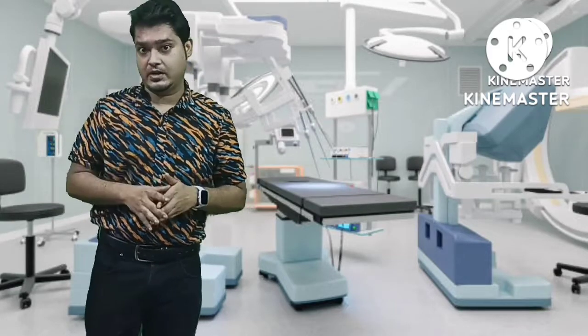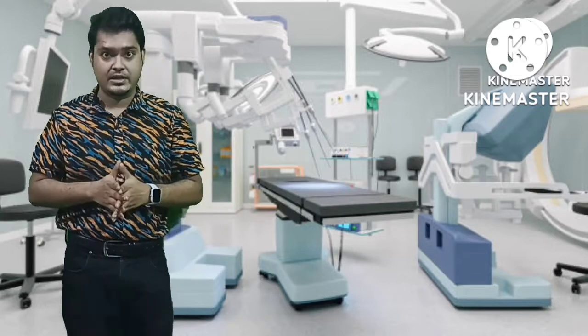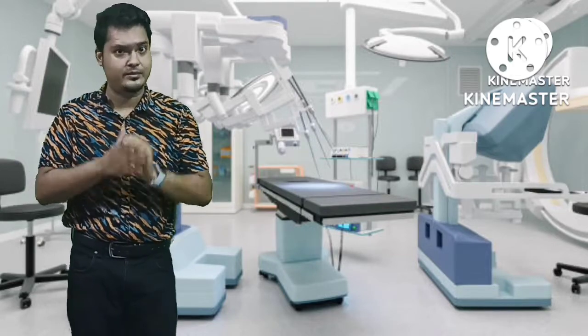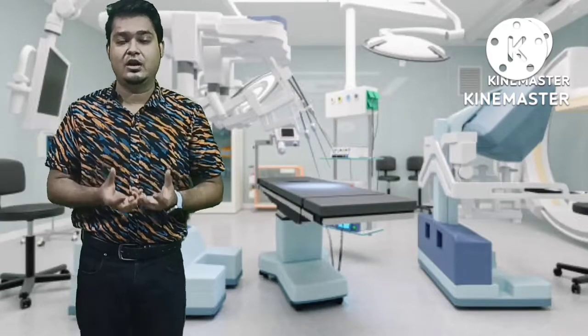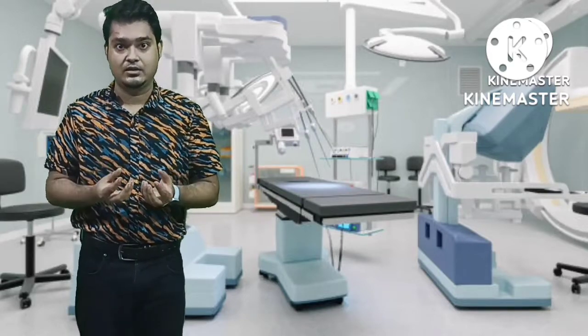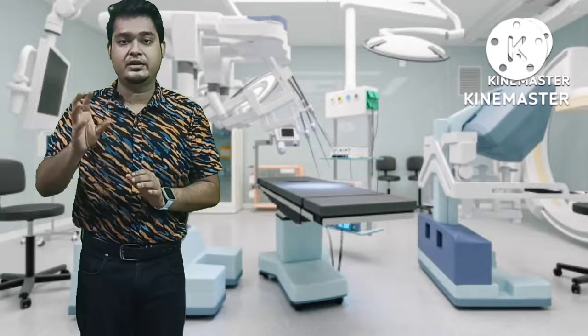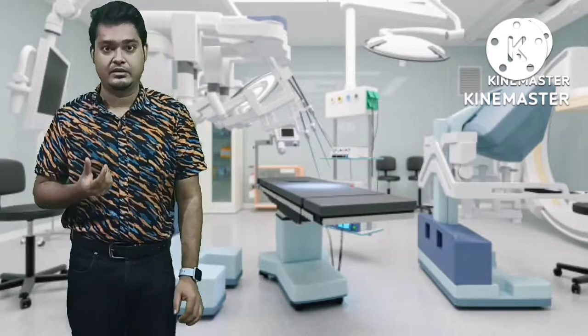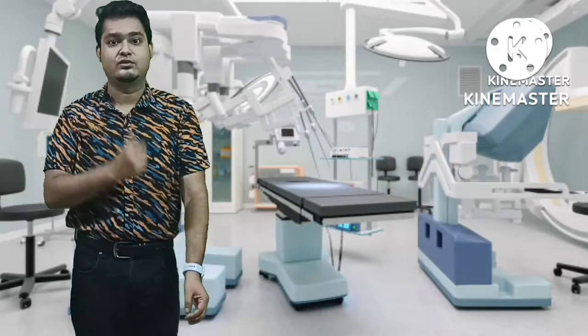Now we are going to discuss what CT coronary angiography is all about. CT coronary angiography is basically a non-invasive or minimally invasive procedure to perform the imaging of the blood vessels of the heart with the help of the radiological contrast media. It does not deal with the use of any catheter, it only deals with the administration of a radiological contrast media through a cannula.